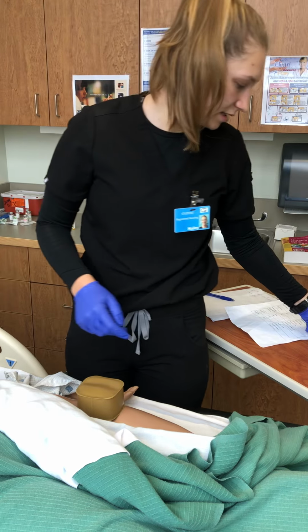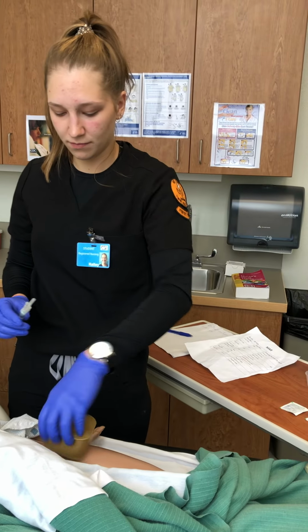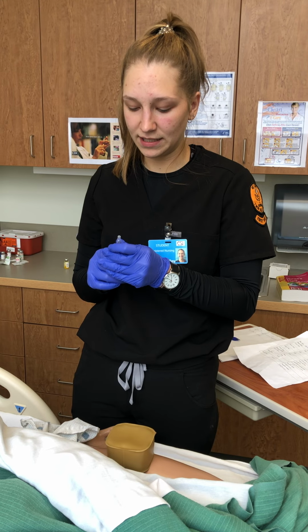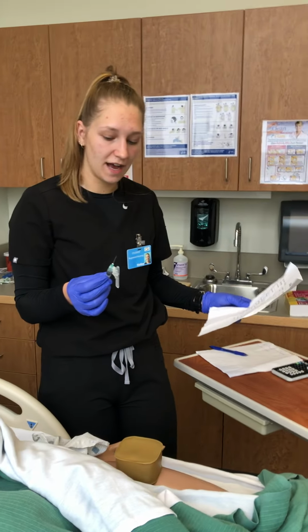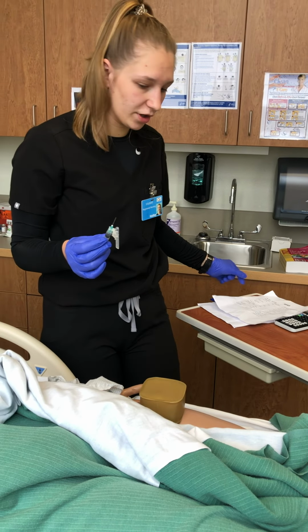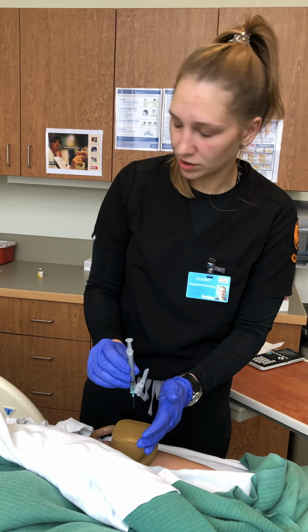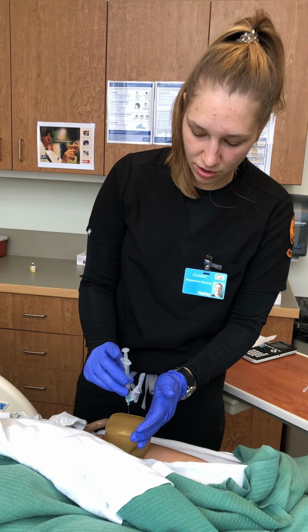before I stab you. Okay, so now that that is dry, I'm going to go ahead and uncap this and do my third medication administration check. I have 0.5 milliliters of morphine and I need 0.5 milliliters of morphine, so I perform the third check. I'm going to do the Z-track and pull your skin taut here, and on the count of 3, I'm going to poke you with the needle and administer the medication. 1, 2, 3.